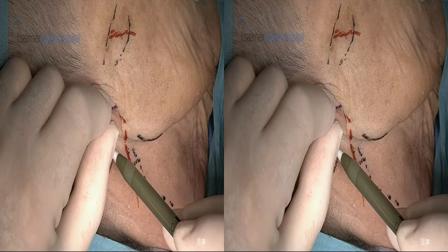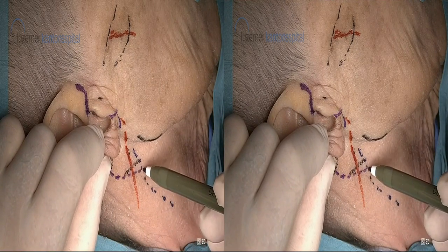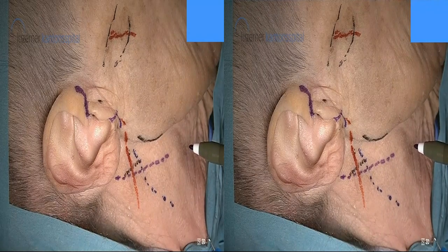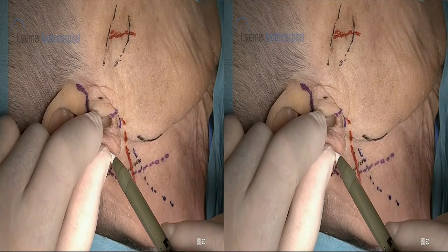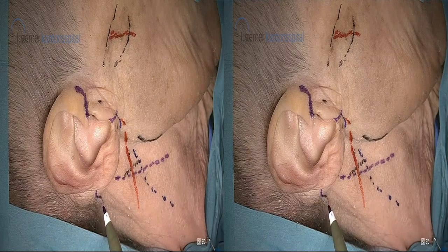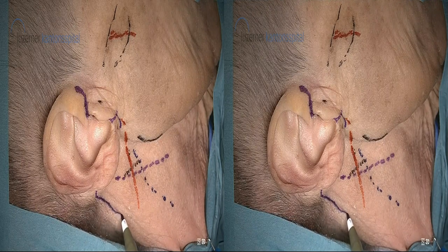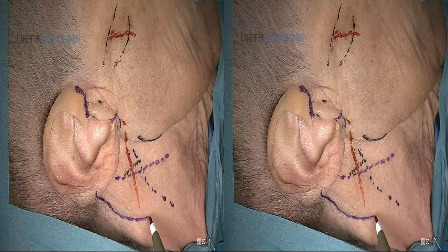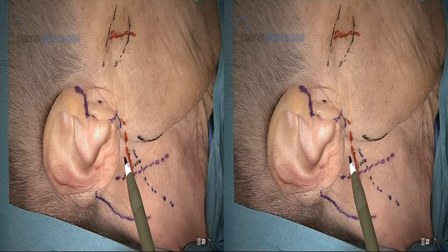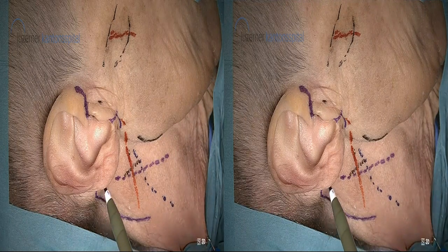Either we do the standard parotidectomy approach by going into a skin crease here and extending it within the skin crease. Or, in case of a younger patient, you want to do a facelift type incision. So you extend your incision behind the ear — you can go even a little upwards towards the hairline. We usually shave one centimeter of hairline for easier wound closure. And then you go along the hairline, and usually you have to go a little bit anteriorly here, again in a skin crease. So with this facelift incision, we hide this part behind the ear, and this one will be along the hairline.